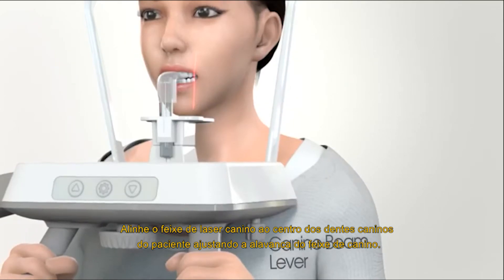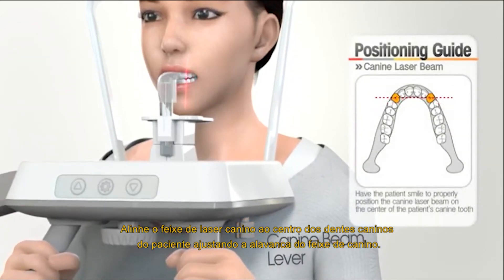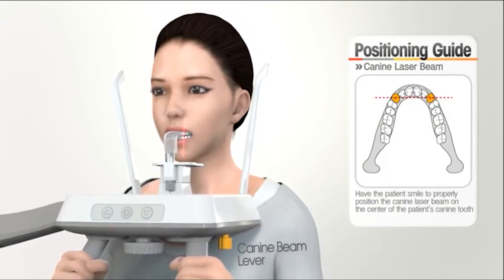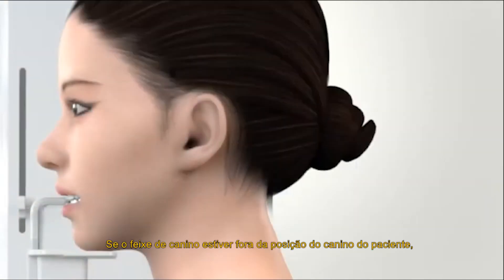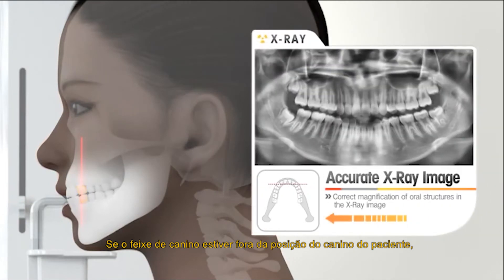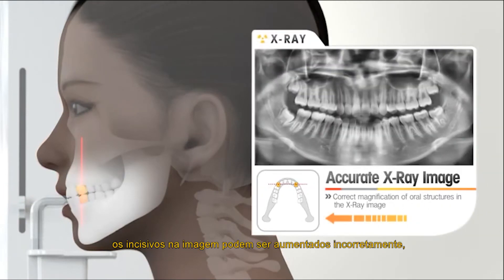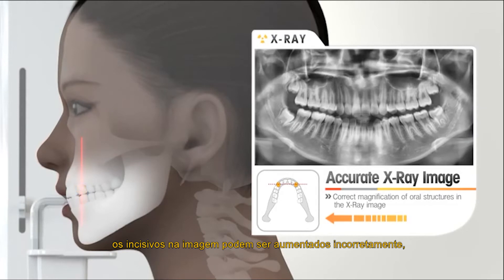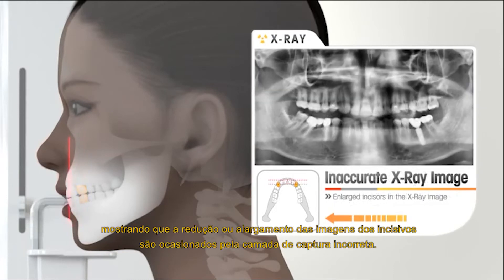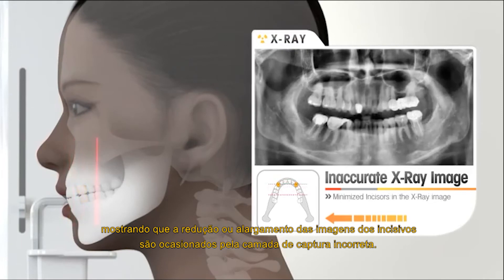Match the canine laser beam at the center of the patient's canine teeth by adjusting the canine beam lever. If the location of the canine beam is off the patient's canine position, the incisor image can be incorrectly magnified, meaning reduced or enlarged incisor images are achieved by an incorrect capture layer.